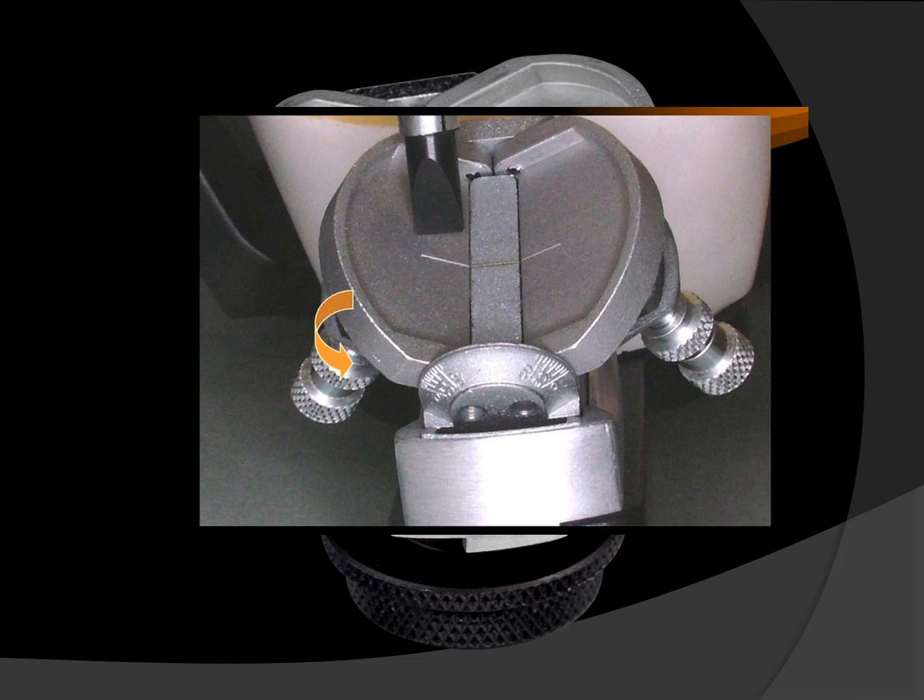So when the teeth are in edge-to-edge relationship, the incisal pin will not touch the incisal guide table. It will be a little bit elevated. So at this time, the incisal table should be rotated anteroposteriorly till it contacts the incisal pin. So this is how we record the protrusive incisal guidance.